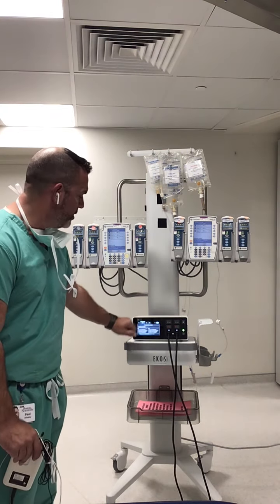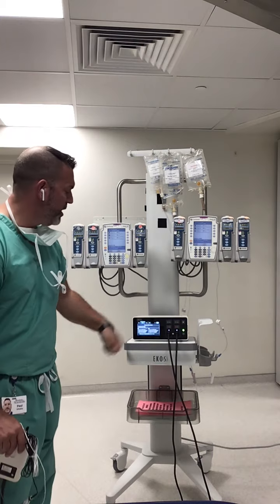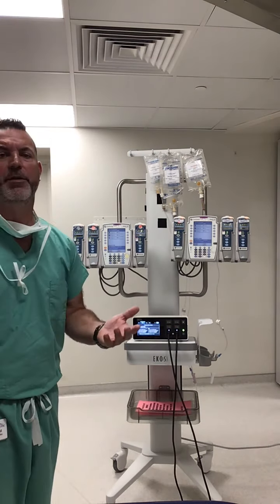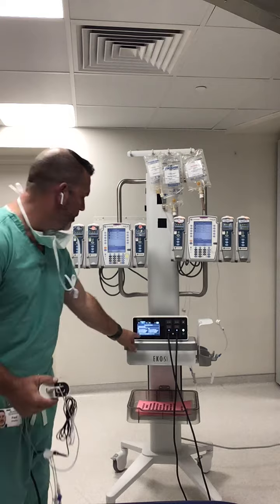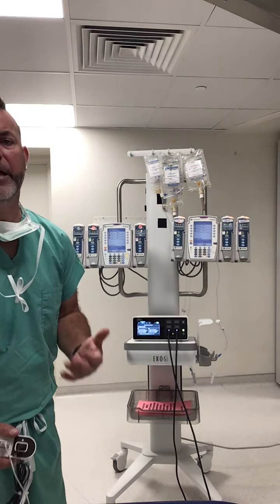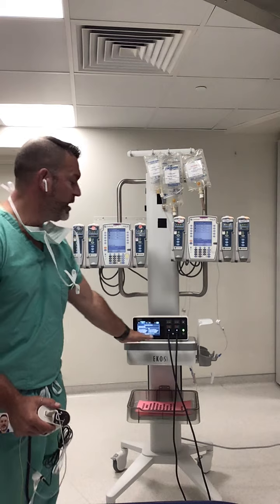The second button to the right is a little eye with a circle around it, and that means information button, okay? When you press the information button, it's going to give you all kinds of numbers and statistics on the machine, serial numbers of my catheter, serial numbers of the remote or the pod. But what I want to focus on is at the bottom down here, we are the only company that offers 24-hour a day, 7-day a week, 365 days a year, holidays, nights, and weekends, EKOS expert help.